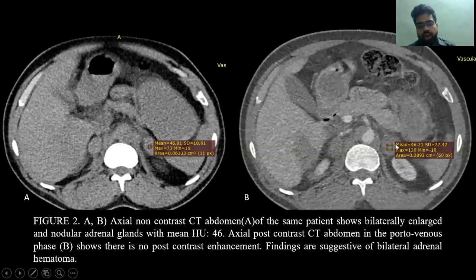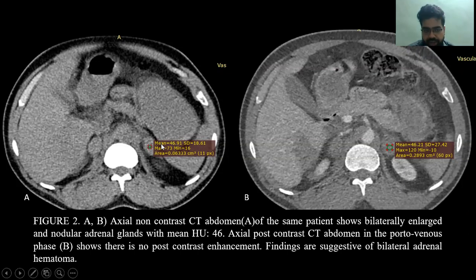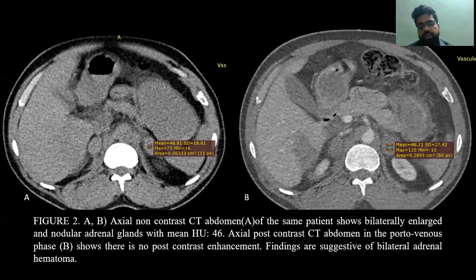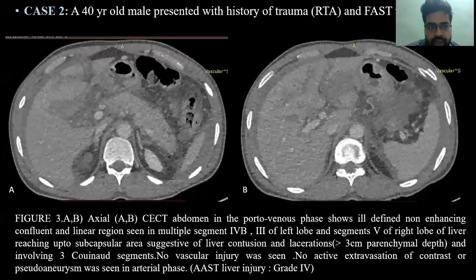Additionally, in the same patient, a well-defined hyperdense lesion was seen in the left adrenal region on non-contrast imaging, which showed no post-contrast enhancement. This was consistent with bilateral adrenal hematoma in the same patient.